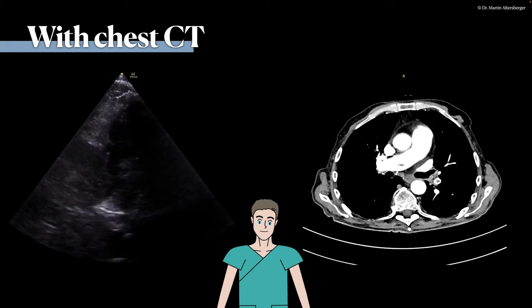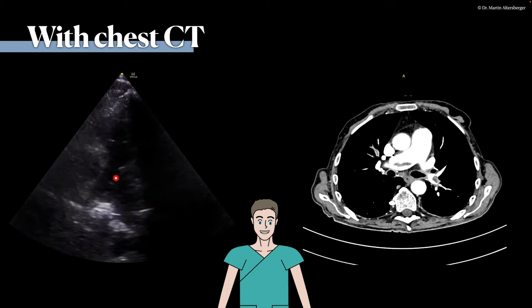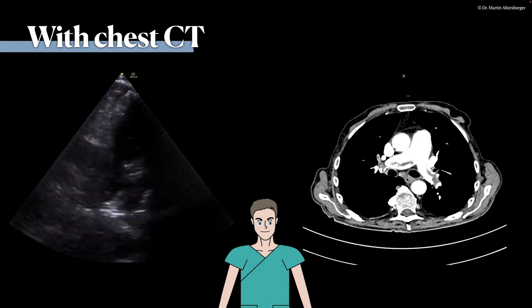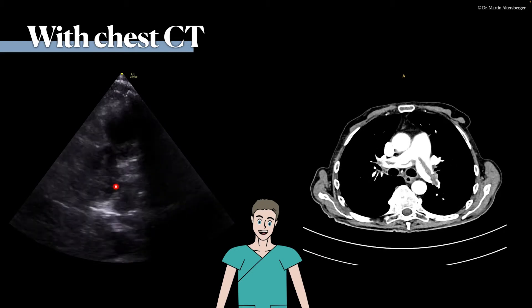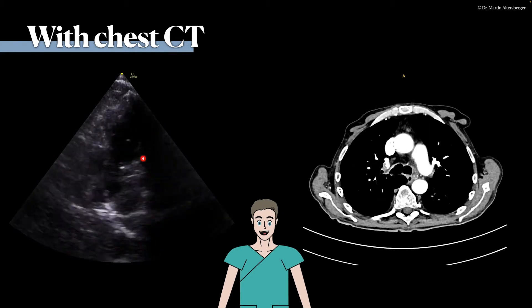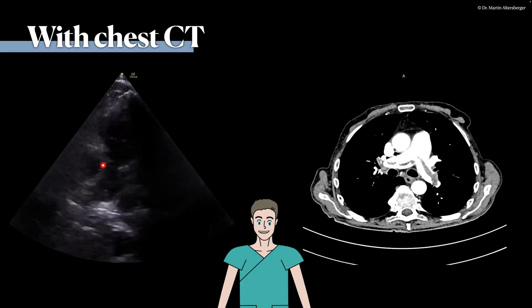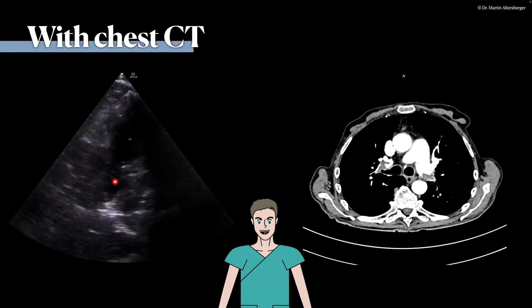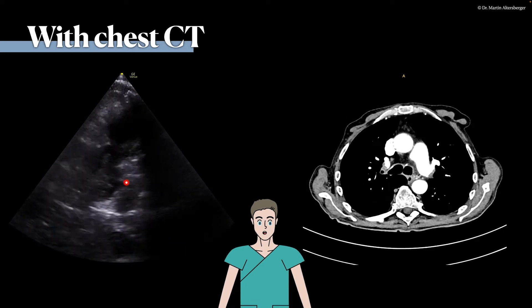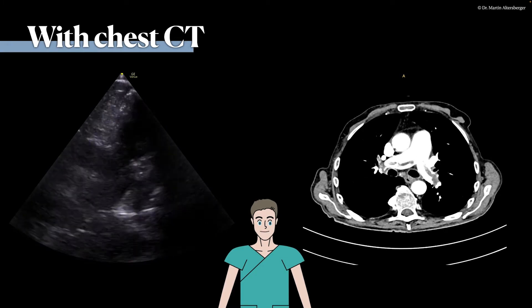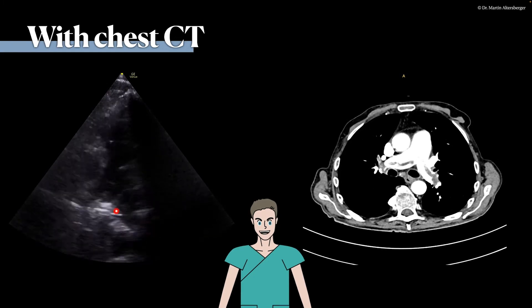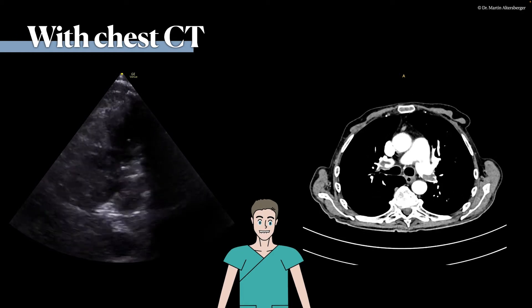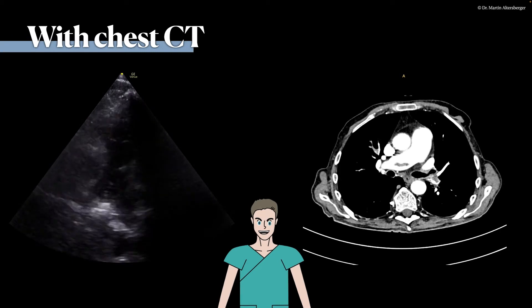Continuing with pulmonary embolism, we have to leave the right heart and move towards the pulmonic valve and the pulmonic trunk. Sometimes in central pulmonary embolism, you will even be able to visualize a thrombus directly. Here we have the pulmonic valve, parts of the pulmonic trunk, and the bifurcation of the pulmonary arteries — the right and left pulmonary arteries. In this case, we do see the thrombus, though it's not always easy to see.